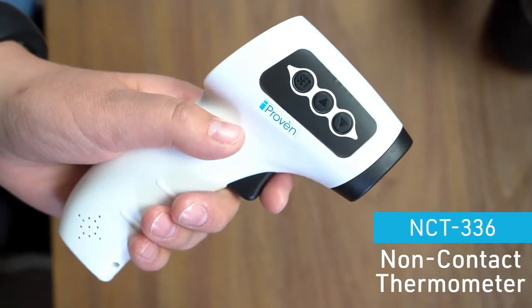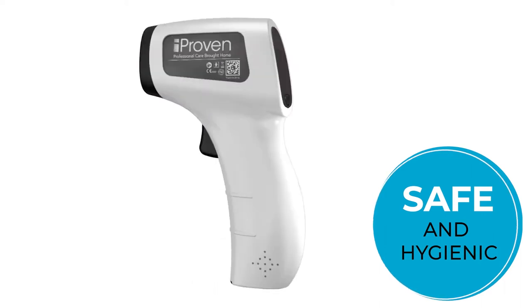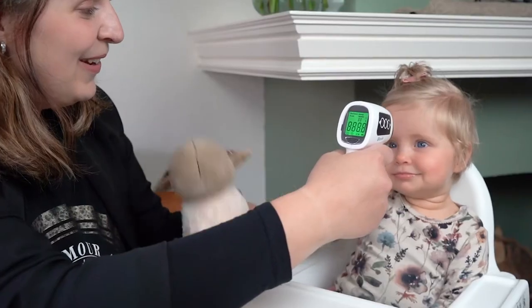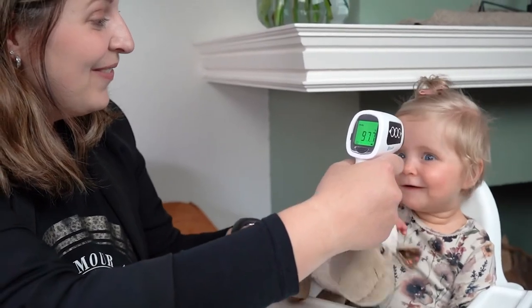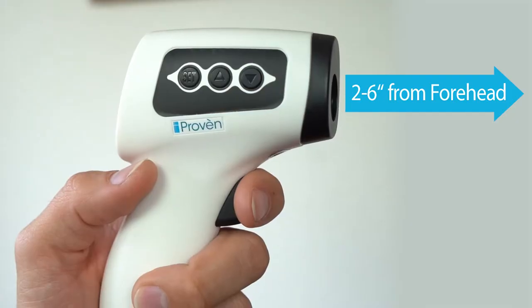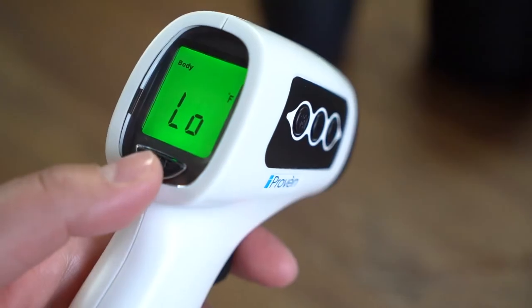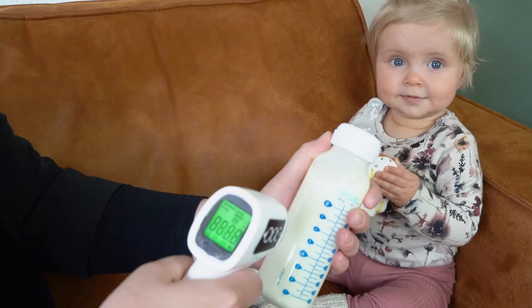iProven's non-contact thermometer is your number one choice for safe and hygienic temperature checking. Designed to measure body temperature at a distance, the no-touch thermometer is not just accurate but also hygienic. Hold the thermometer at a distance of two to six inches from the forehead for the best results, or check the temperature of any object or room.